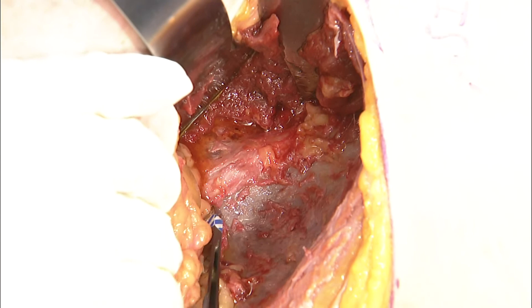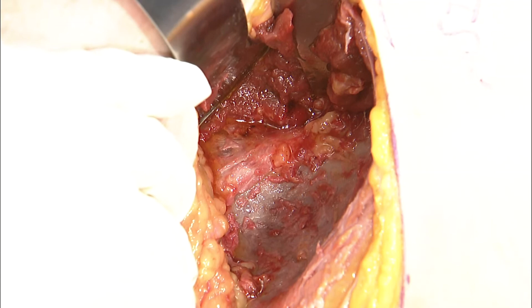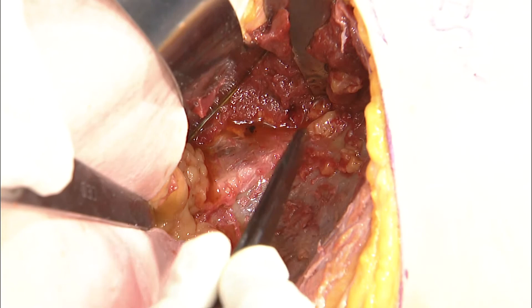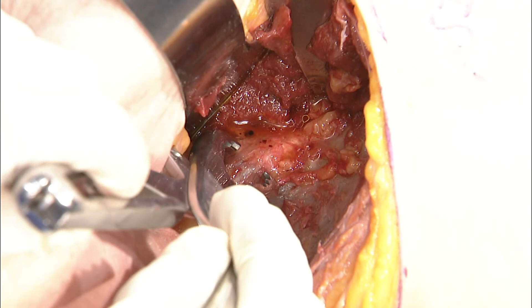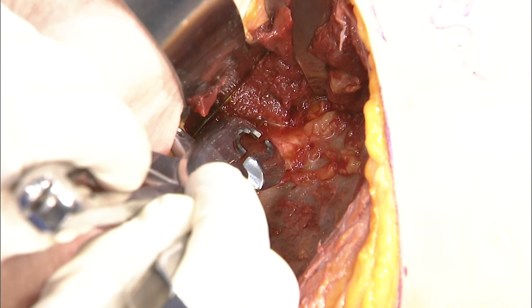For getting reduction of the sacroiliac joint, there are a number of different ways. One way is to use a plate applied as a buttress here, and a second plate applied very proximally. Adding another Hohmann retractor up here helps get that exposure for plate placement. Sometimes you still need compression across the joint — an easier way is to use a Farabeuf clamp or a Jungbluth clamp, placing a screw between the plates onto the sacrum and onto the ilium, then applying compression. Being supine makes it easy to then add your iliosacral screw trajectories.